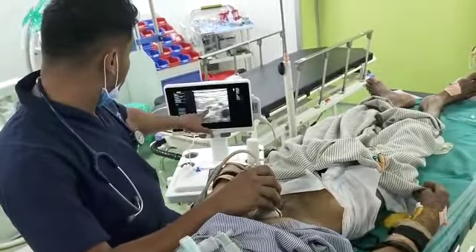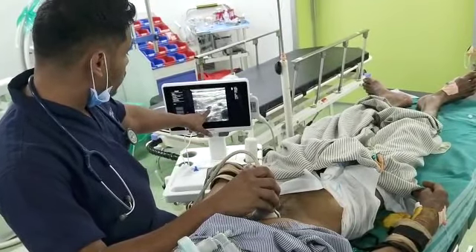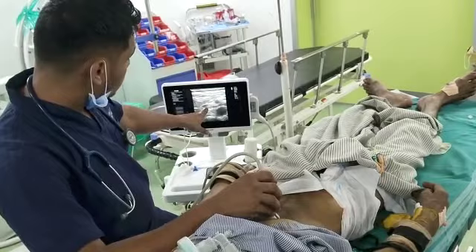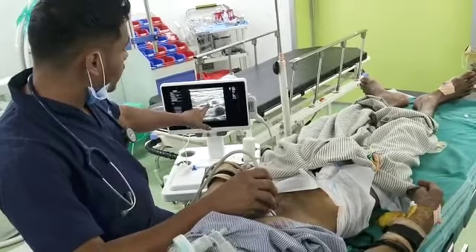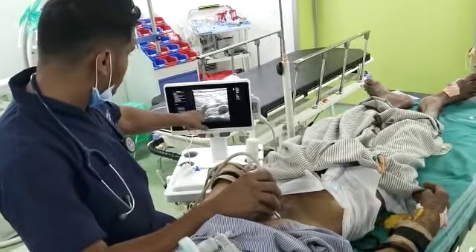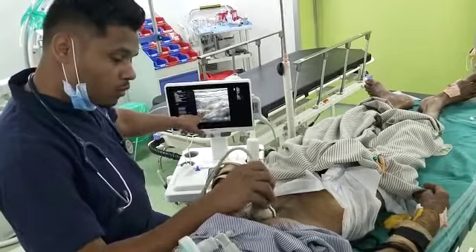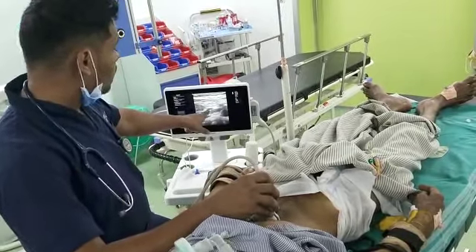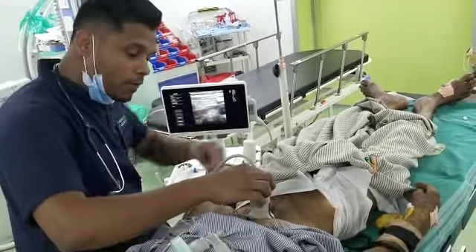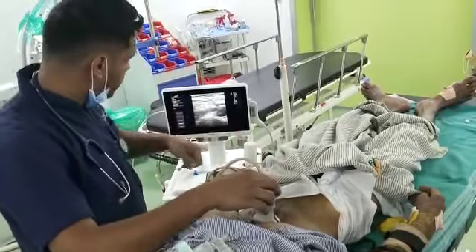So this is the IVC. Now I am going to compress this vessel, and it is going to take the shape of a tear. Now we have to measure — the probe is horizontal to the abdomen.